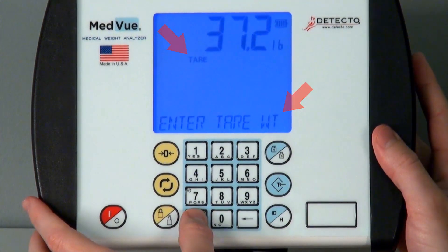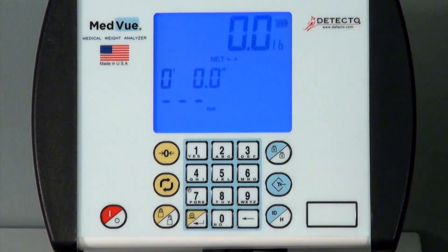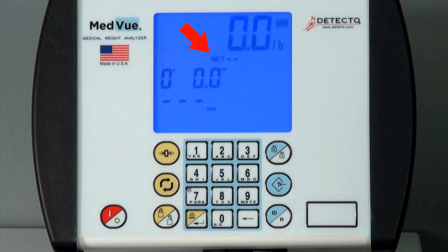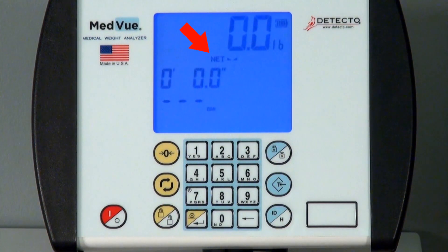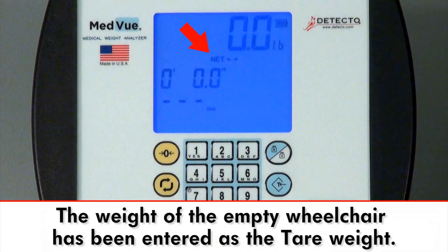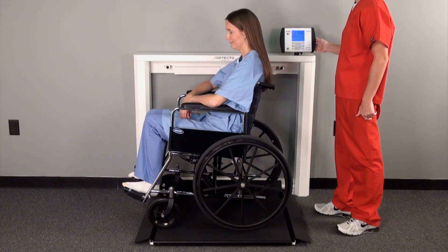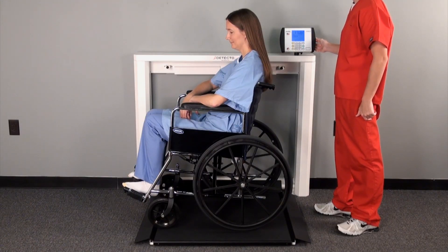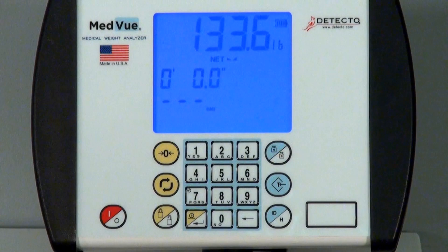Next, press the Enter key. The display will then change to zero and the net enunciator will toggle on to show that net weight is now being displayed. The weight of the empty wheelchair has been entered as the tare weight. You may now use that wheelchair to weigh the patient on the scale and then read the patient's weight accordingly.